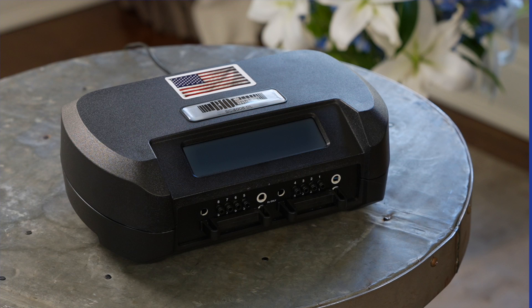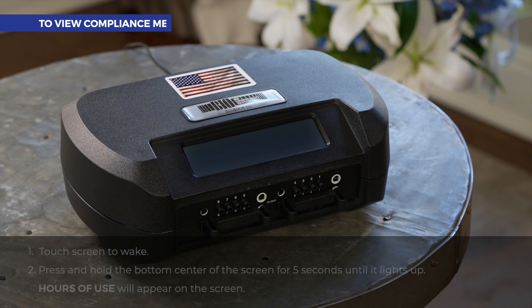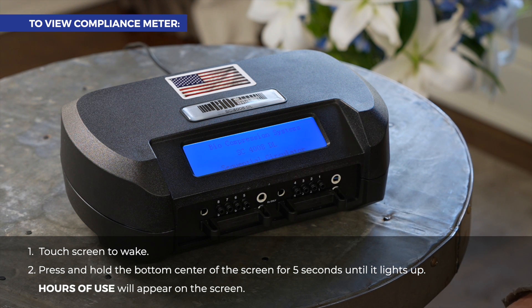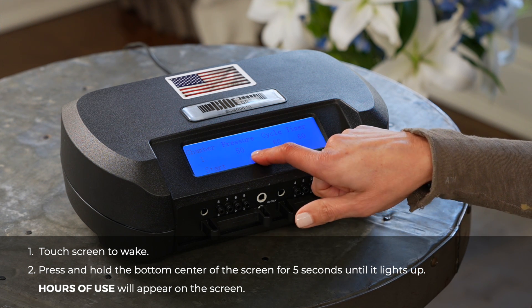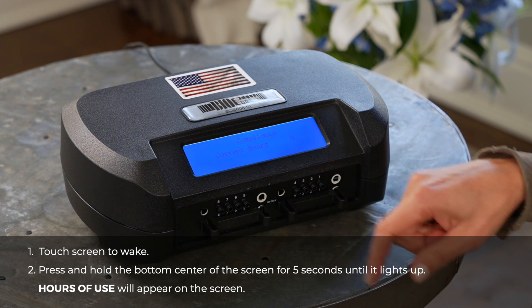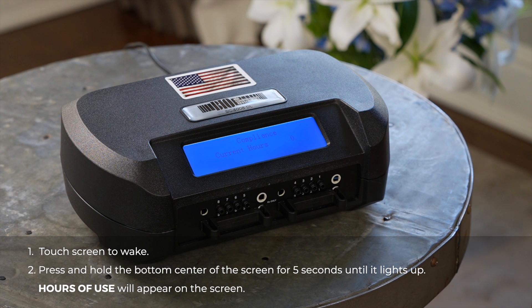To view your treatment compliance meter, otherwise known as hours of use, touch the screen to wake. The opening screen will be displayed, then it will change to the settings screen briefly before the start screen is displayed. While the start screen is displayed, press and hold the bottom center of the screen for five seconds. Your compliance hours will now be displayed.